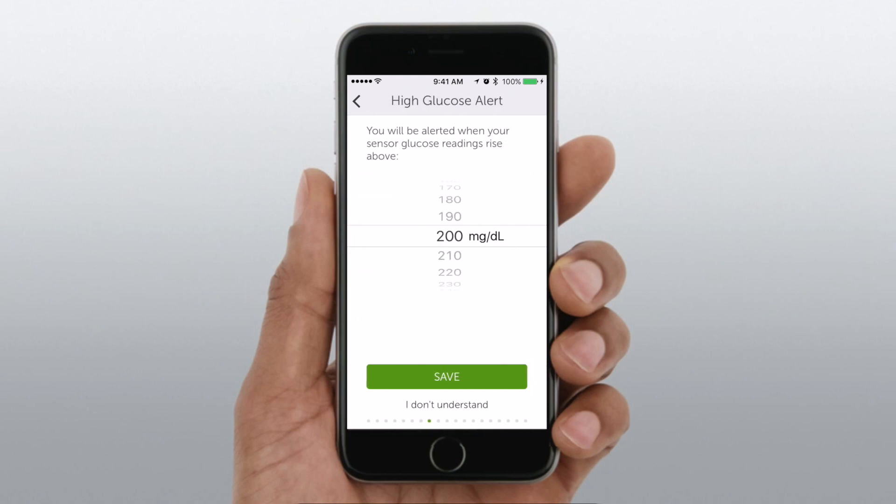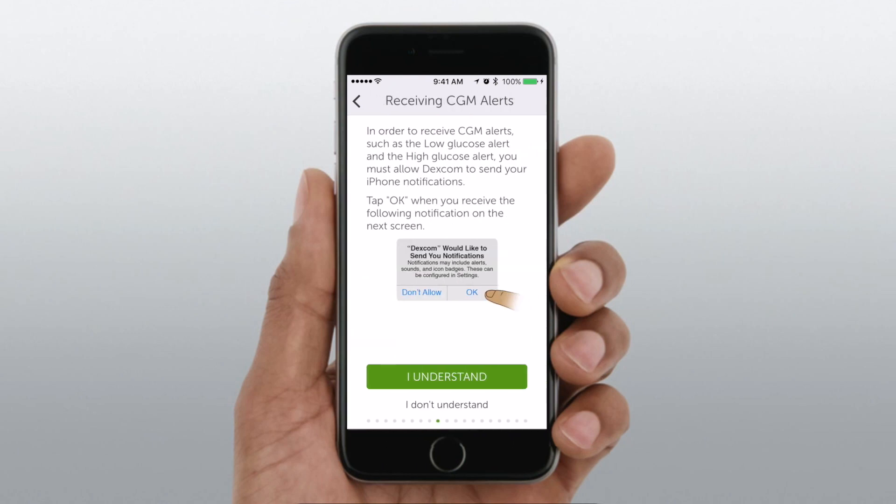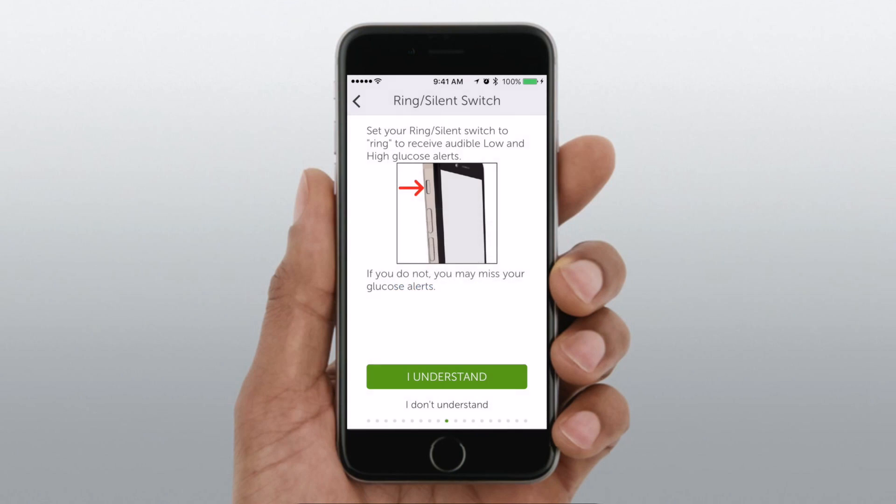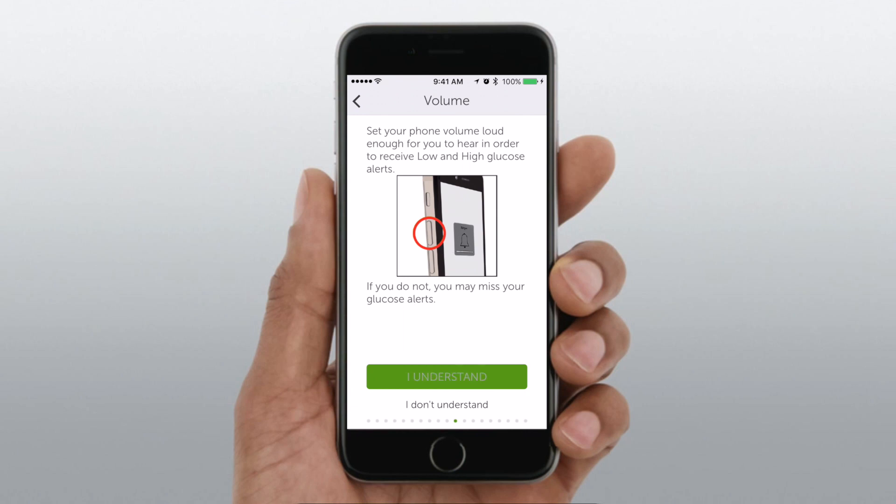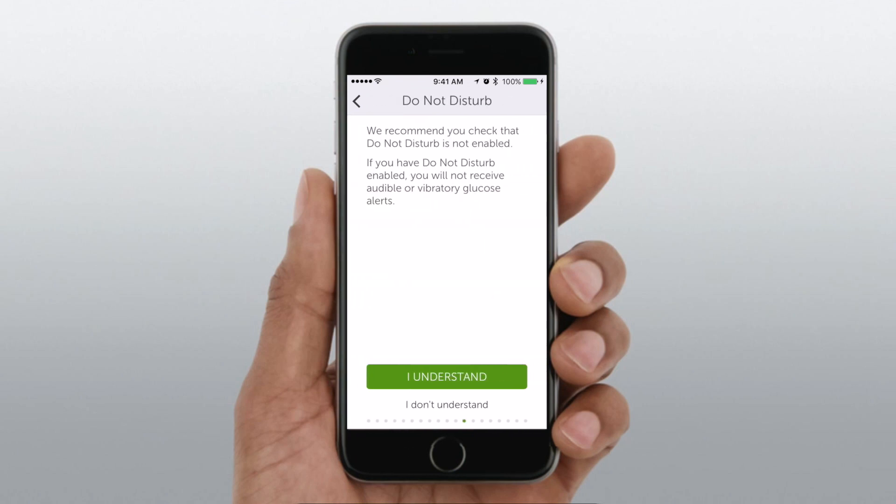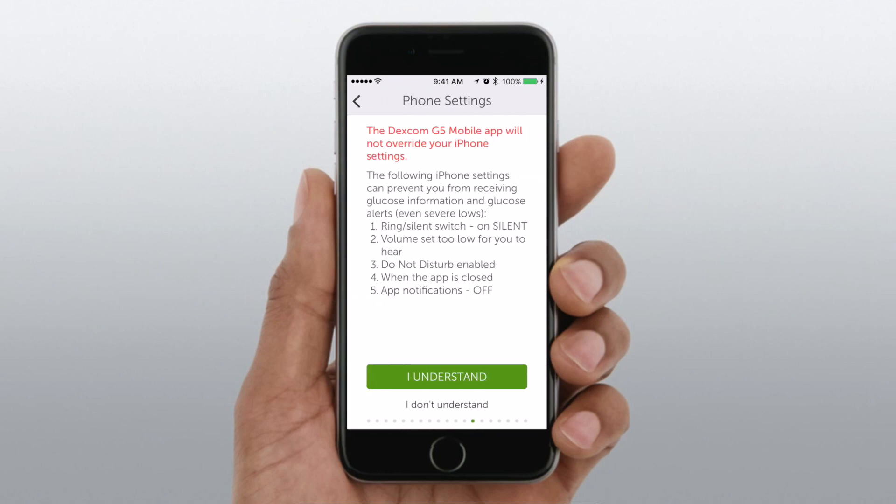We're going to choose our low glucose alerts such as 70. We're going to set our high glucose alert. For me, I'm going to put 200. And then we're going to be notified about accepting those push notifications. We're going to be notified, hey, if you have your phone on silent, you are not going to get those low alerts. So do not use do not disturb. Make sure your volume is up. All this stuff, especially for overnight. So if you have the sensor on there before your receiver would wake you up, now you kind of have to use your phone. So if your phone is on mute, you're not going to get those warnings.